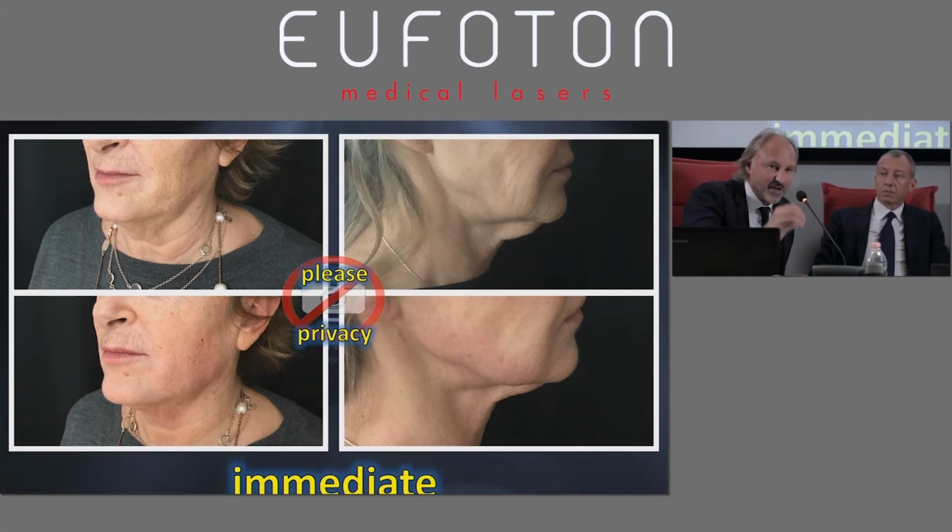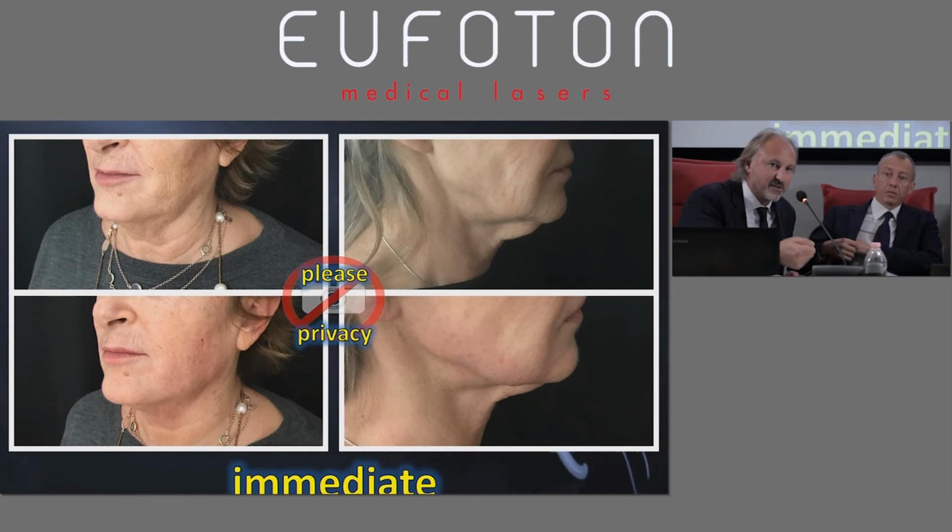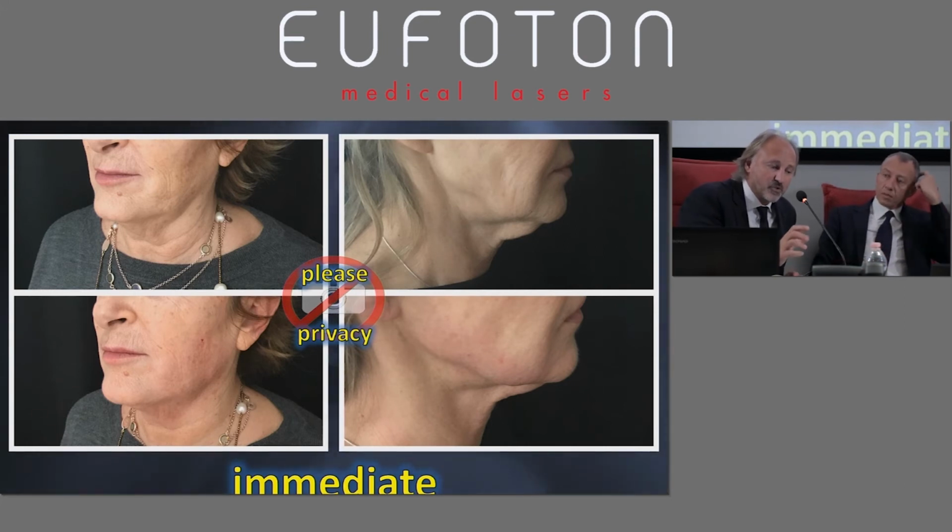If in your cultural heritage and manual skills you also have surgery, you're also a good surgeon, no one asks you not to suction after the laser using a traditional liposuction cannula, or a cannula already designed to do laser lipolysis and suction at the same time.